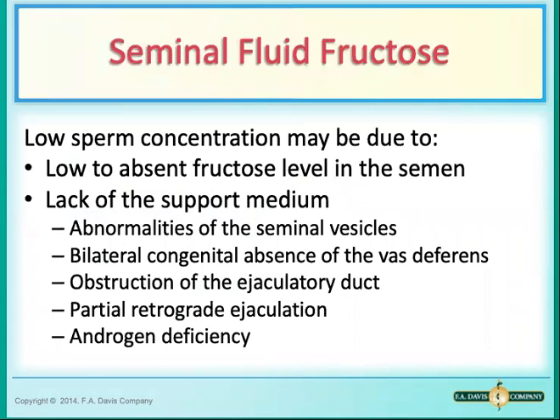And this is exactly what I just talked about, the seminal fluid fructose and the test that we can do. A normal quantitative level of fructose is equal to or greater than 13 micromoles per ejaculate. Again, we can use spectrophotometric methods to determine this, and specimens for fructose levels should be tested within 2 hours of collection or frozen to prevent fructolysis.